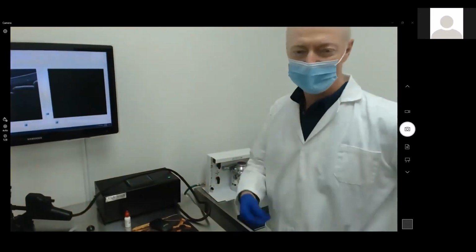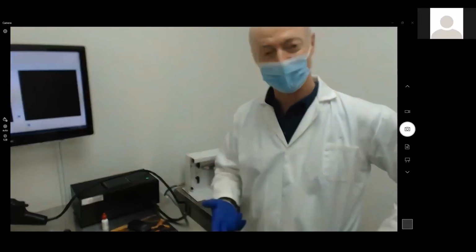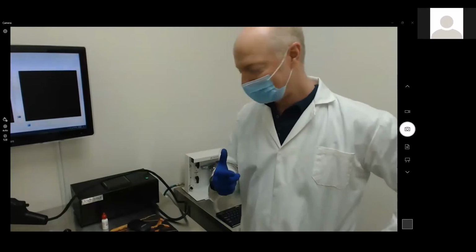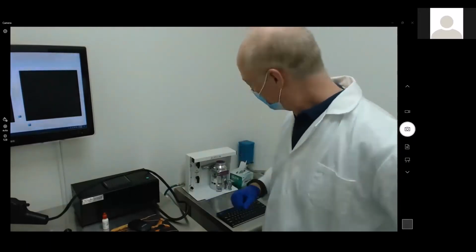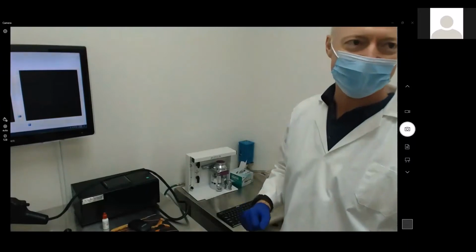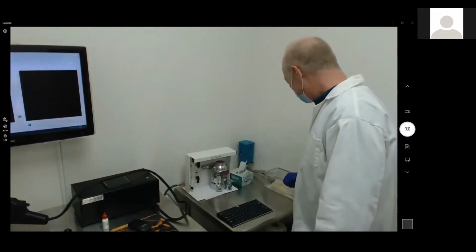All right, very good. Wet lab number 2, Saturday. What we're going to do on this wet lab is OCT on a rodent. In this case, we've got a rat that we've anesthetized, and we're going to put the rat on the table. This is Fat Rat. Fat Rat's been around here for a few years now, and we definitely love her. We take good care of her.